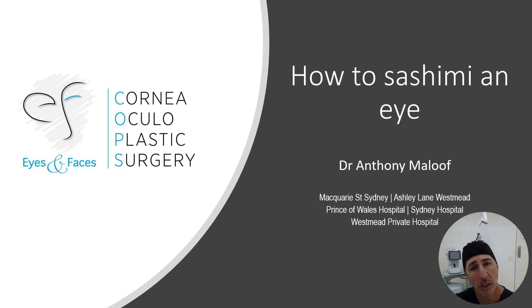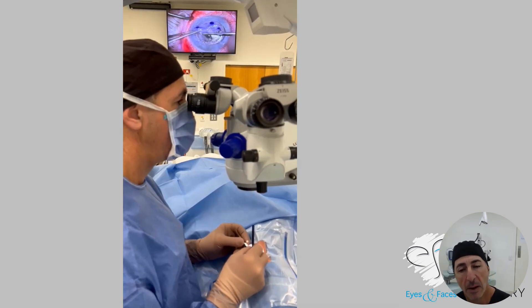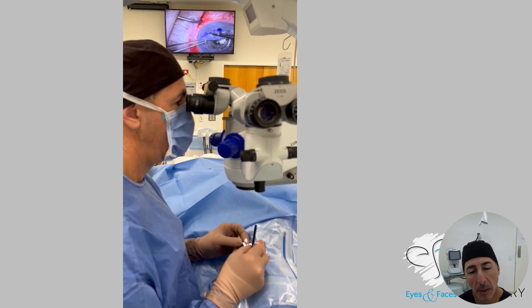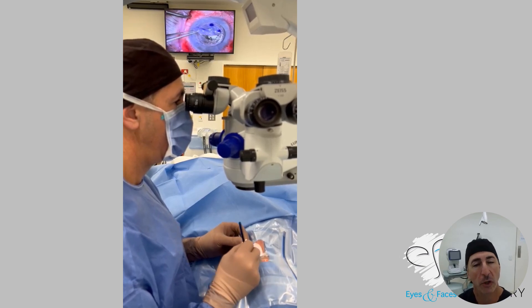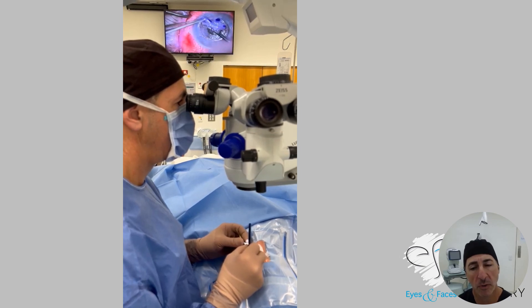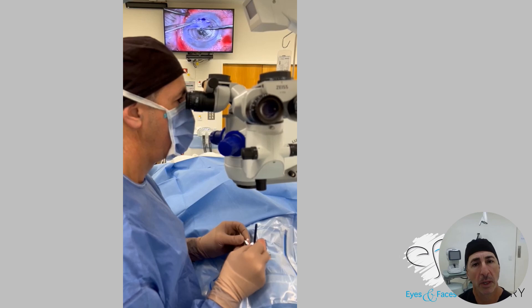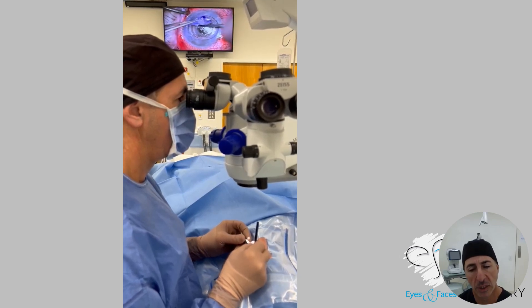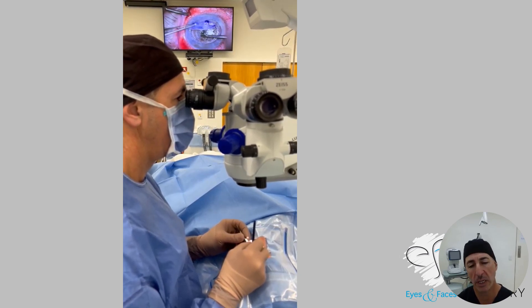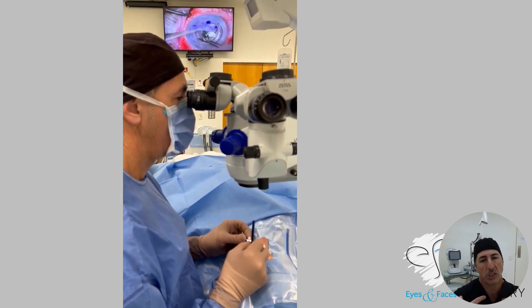Everyone asks me how I do it, so let me show you. You'll see the video in the background — the top view shows the instruments moving. But if you watch my hands, not much is happening. See the tips and instruments moving in the distance, but my hands hardly move. They're resting on the forehead, functioning through the engagement of my shoulders, which connect to my core.